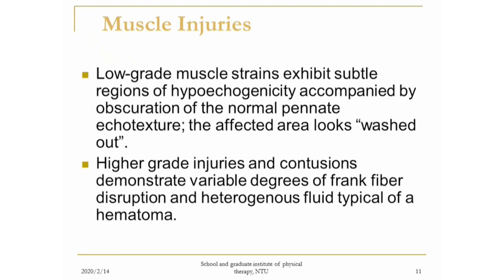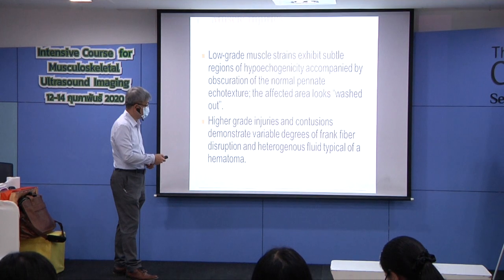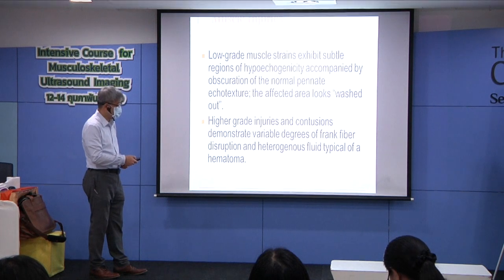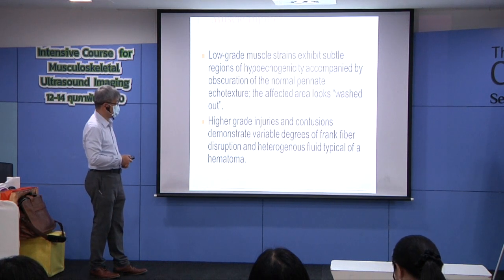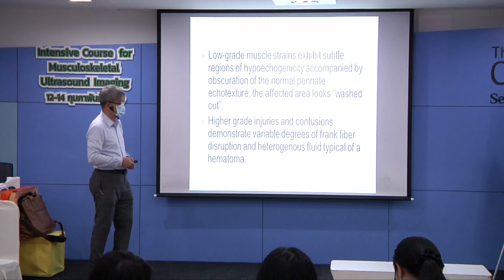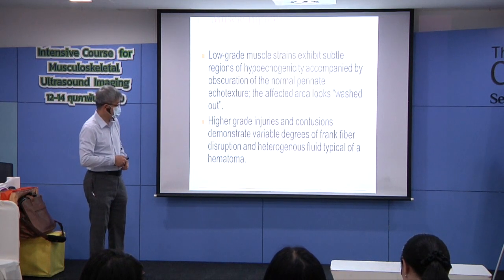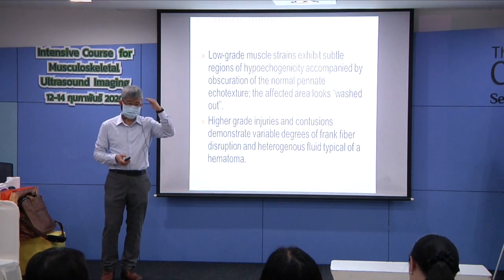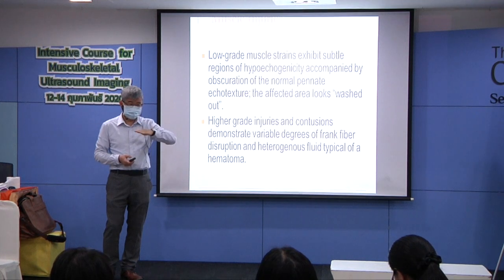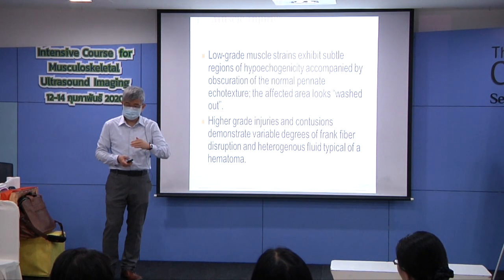Okay. If you find the fascicles and the pennation disappear in some hypoechoic area, it is an indication of muscle injury. But remember, when you are going to make this kind of assumption, muscle, fat, superficial aponeurosis, fascicles, pennation angle, deep aponeurosis, bone, everything in your imaging has to be clear.